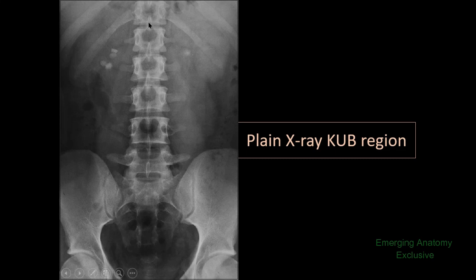Now, come to these structures — what is this? These are the tips of the spinous processes. But remember that this tip of the spinous process belongs to this vertebra. And this tip of the spinous process belongs to this vertebra. This one is for this vertebra, and the other tips of the spinous processes similarly correspond to their vertebrae above.